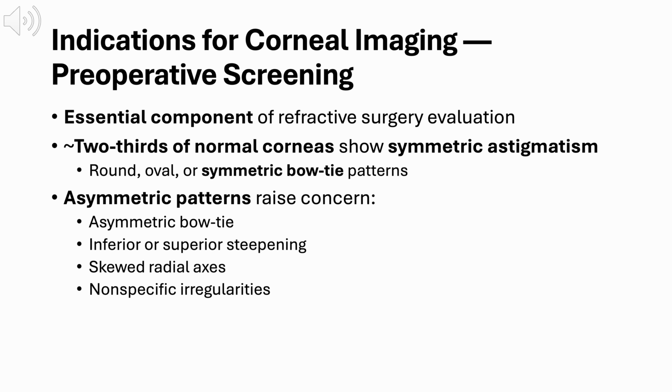The key point is that symmetric patterns are common and usually benign, while asymmetry is what triggers deeper evaluation, often with tomography and posterior surface analysis, before considering refractive surgery.